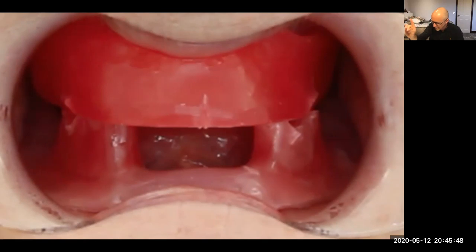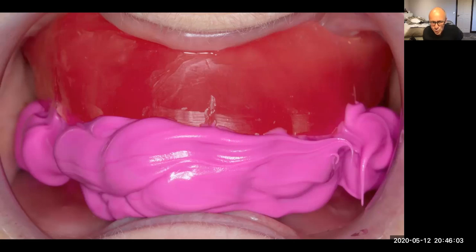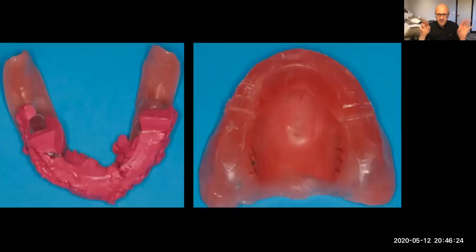So that's first. And then I inject at this point with the patient biting together, with Claire holding the retractors and the patient's teeth together, I squirt in Futar D between everything. So the patient is not closing down through that medium. They're touching together first, and then the Futar D bite registration is squirted in, and I wait for 2 minutes for it to set. And then that is our intermaxillary record done.